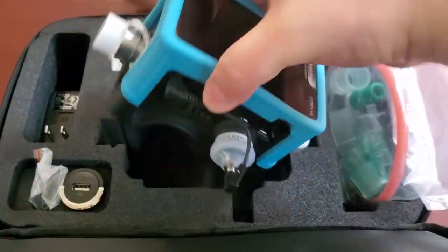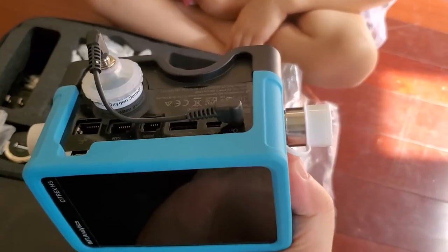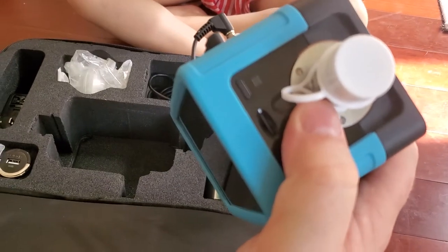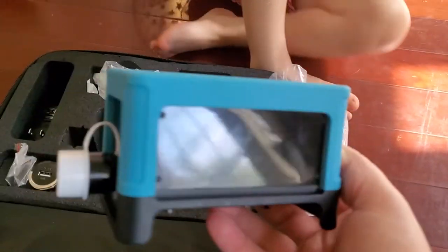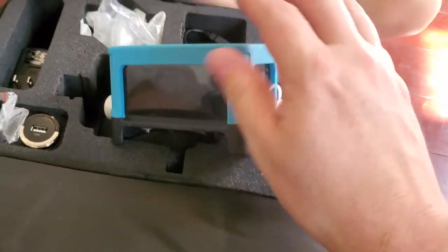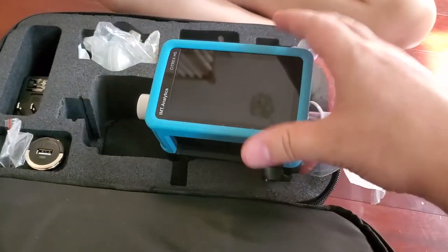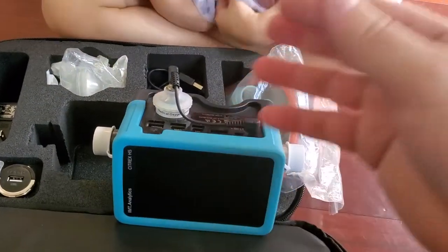So the Citrex H5 is a ventilator analyzer, but it can also do other things. It does oxygen percentages, and you can attach accessories to do things like anesthesia agents — there is an attachment for that. We will do a more in-depth review later. This is way different than the stuff I'm used to using. It's got a graphical interface and different profiles for different ventilators, whereas a normal vent tester just does pressure, oxygen percentages, and flow.